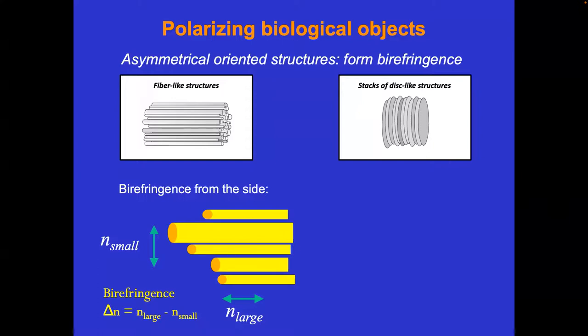Because how do you create delay? Think about how you understand how a refractive index actually works in material and glass. It depends on the level of analysis. Well, let's say the beam goes through air, you don't excite anything. But then you go through glass, you excite the electron clouds, like I explained with Rano, right? So the electron clouds start oscillating, and it's these oscillating clouds that emit another secondary electromagnetic wave.